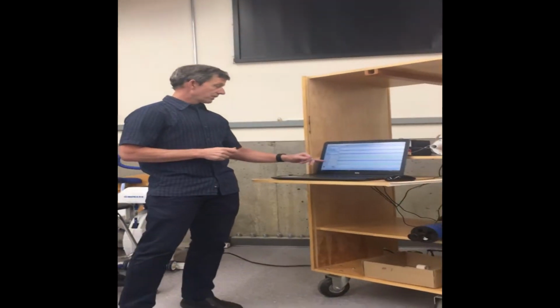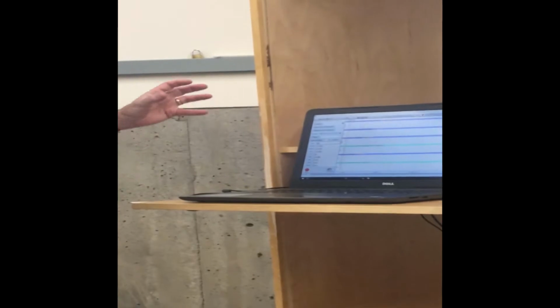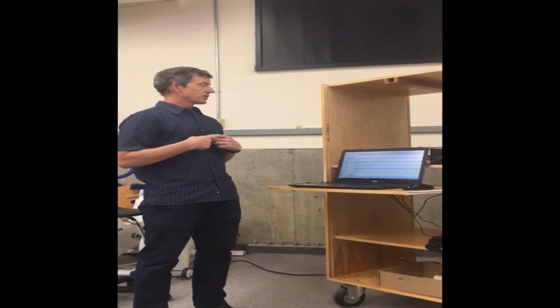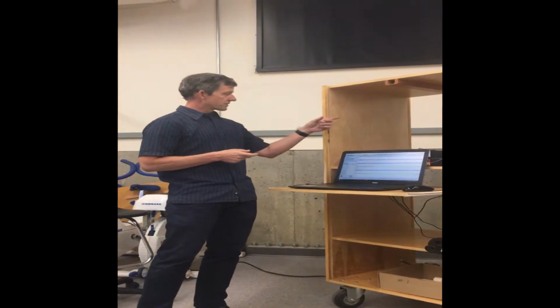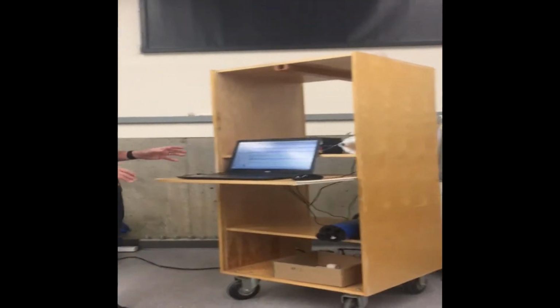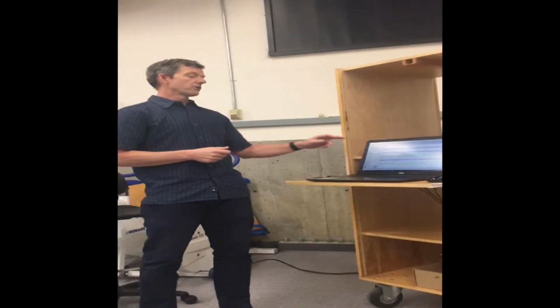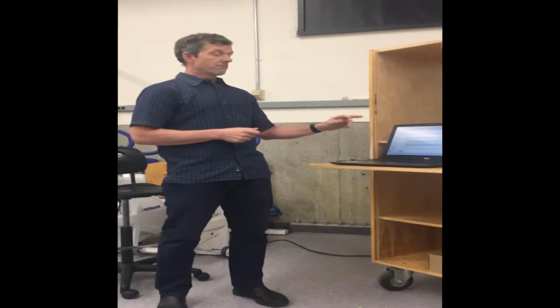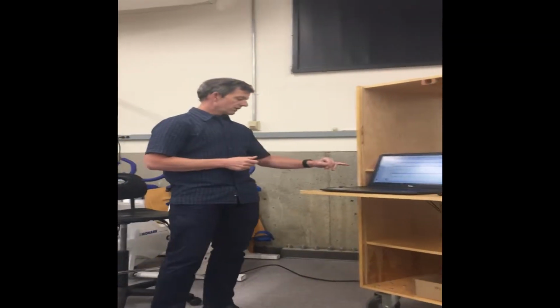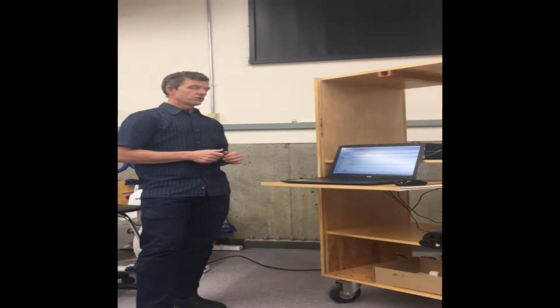It'll also display heart rate. So for this system, we have a Polar heart rate monitor, and the normal chest strap will then send the signal to a receiver that's on the treadmill, and that information goes directly into the TA, and then that is displayed on the screen. So the nice thing about this system is in real time we can look at what our CO2 value is, what our oxygen value is, what our ventilation is, and then we can look at heart rate as well. Over here it'll also tell us what our relative VO2 is.